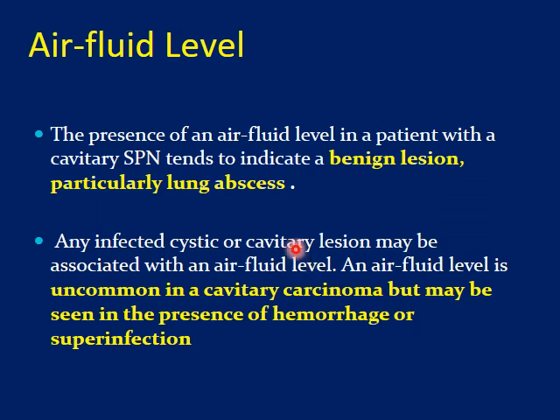Presence of air fluid level. Usually it is diagnostic of lung abscess. As I have told you, sometimes we have the entity of malignant abscess that can suffer from superadded infection, hemorrhage, and so on. But air fluid level in a lesion in the clinical status of fever, leukocytosis, and so on is suggestive of lung abscess.